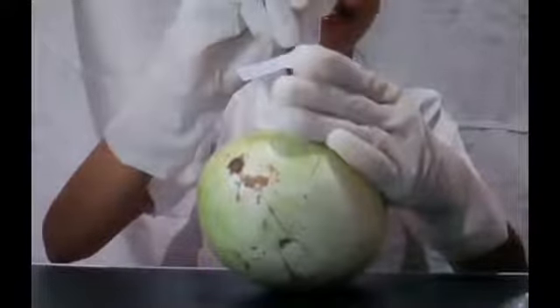So it is labeled medication, and we're going to give it in the deltoid. So we will use our hand to move the skin off to the side, and then at the 90-degree angle you can inject. See? So that's our parenteral medication.